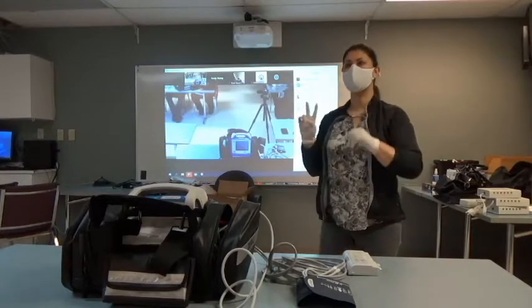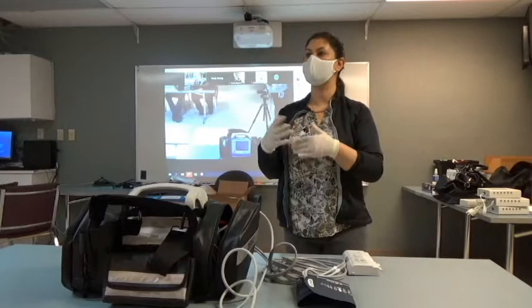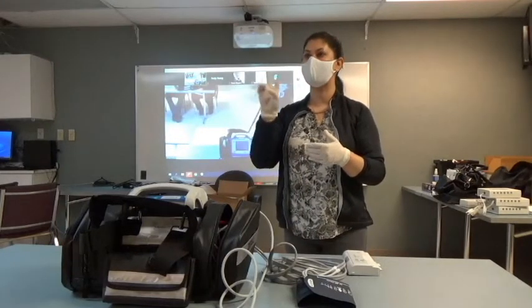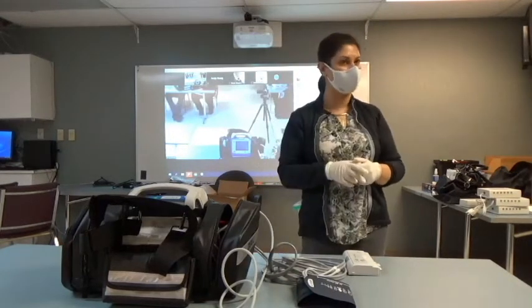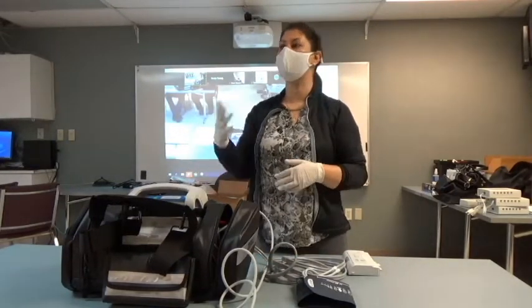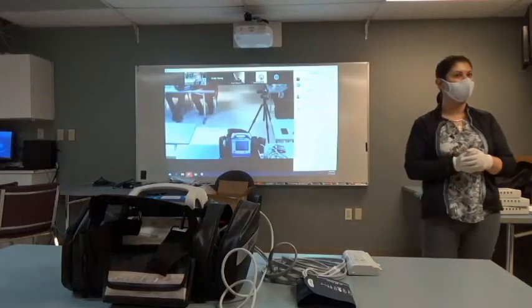This device has a 2-minute internal battery inside. Every time we turn this off, we have 2 minutes to keep it on the current case. So if you need to swap batteries out, it's got a 2-minute internal battery. Every time we turn this on, it's going to run through an operational test. It's going to check your printer, it'll check the device. The only thing it doesn't check is that defib cable that we checked out at some point during the day.